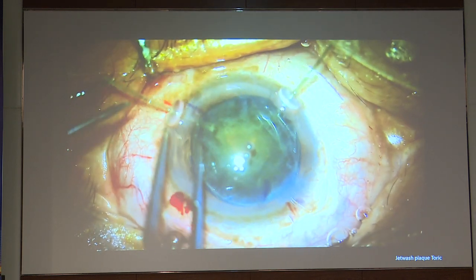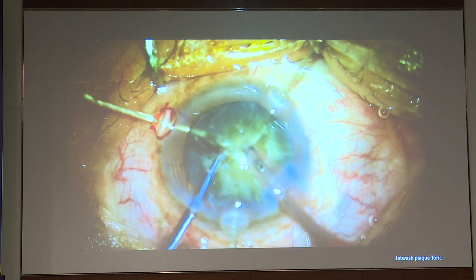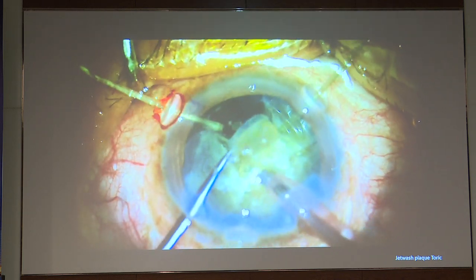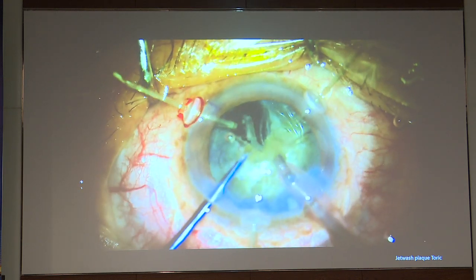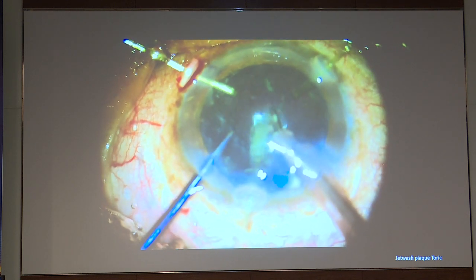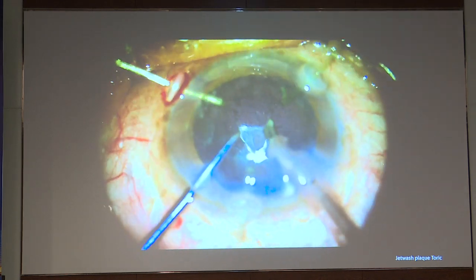because we didn't want to take a lot of risk with the bag which was moving around so much. It was obviously a very, very hard cataract, but even with a small rhexis, staying in the central zone, we could manage with gradually getting everything out. And of course using the capsular hooks for stabilizing the bag because the bag was quite mobile, and being a one-eyed patient, we didn't want to take any risks whatsoever.